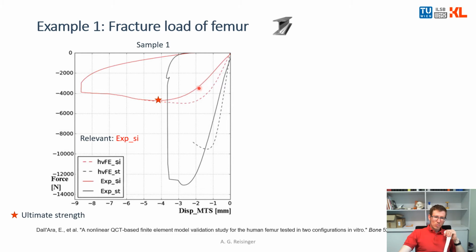Okay, so the load was rising until this value, slightly below 5,000 newtons. This was the maximum load, and then with further deformation the load was dropping. Here Enrico stopped the machine, and then he started to unload, so moving up with the load introduction parts.